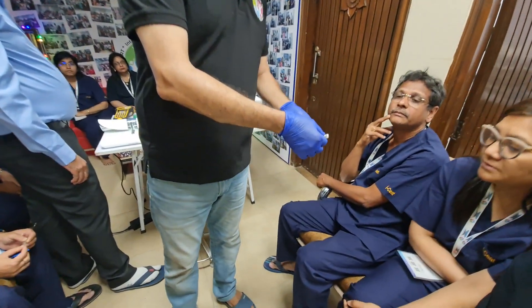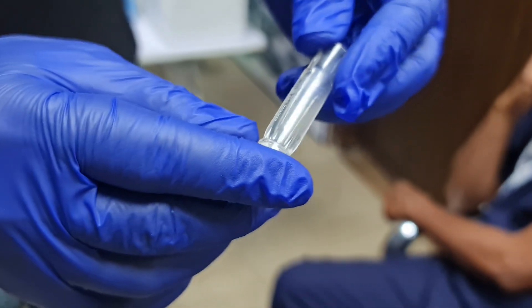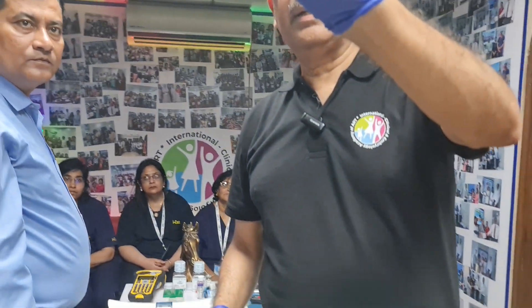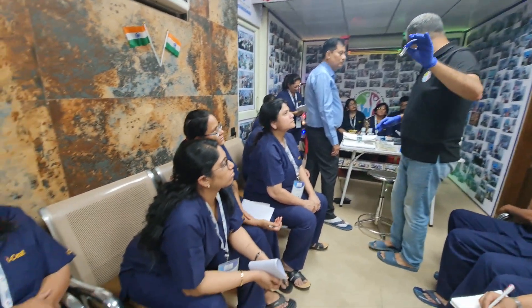The scanner chip is over here. Once you put the semen sample, the scanner chip reads it. This is from a company called CBS. The purpose is that when we put the semen sample here, by scanning we'll know which patient's semen sample it is.